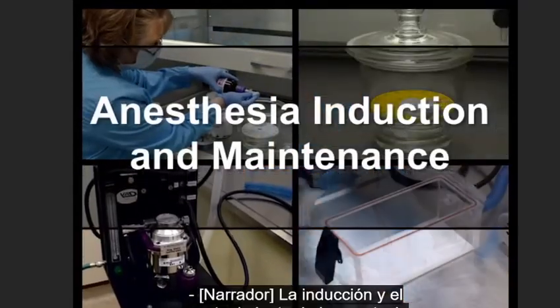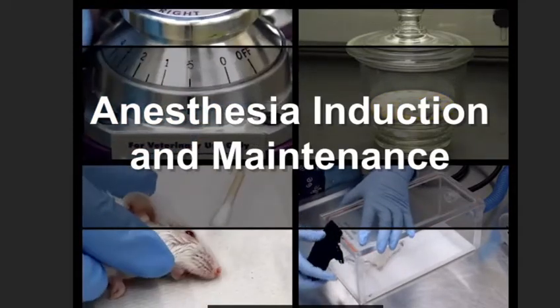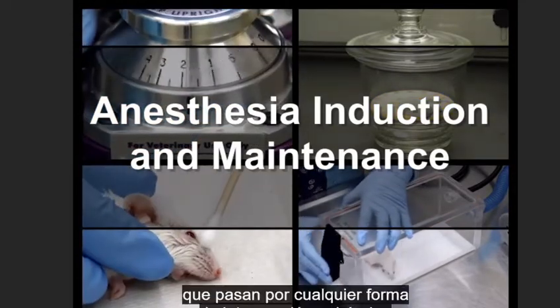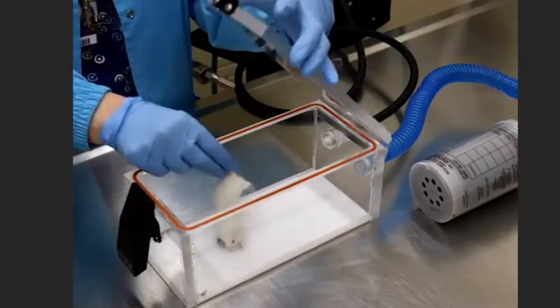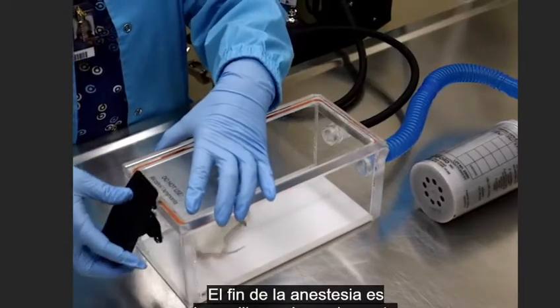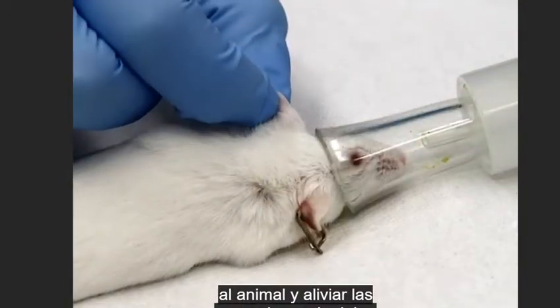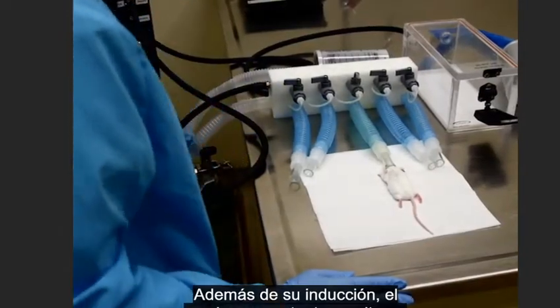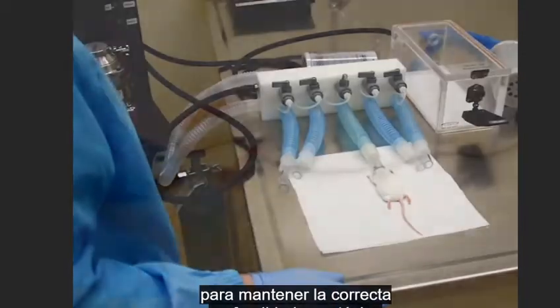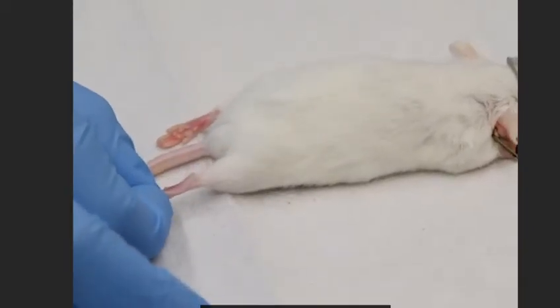Anesthesia induction and maintenance forms an integral component of veterinary care of laboratory animals undergoing any form of surgical procedure. The goal of anesthesia is to adequately immobilize the animal and alleviate all pain sensations. In addition to induction, precise and constant monitoring is required to safely maintain the correct anesthetic depth throughout the procedure.